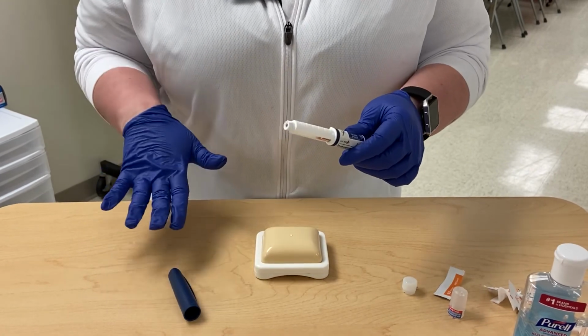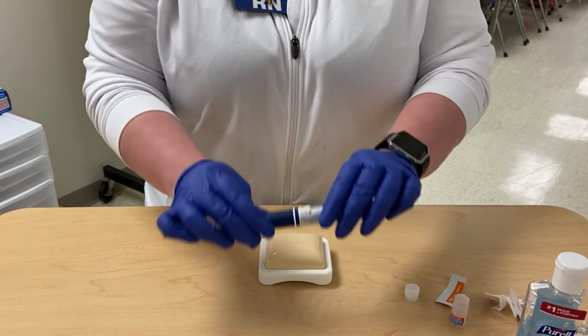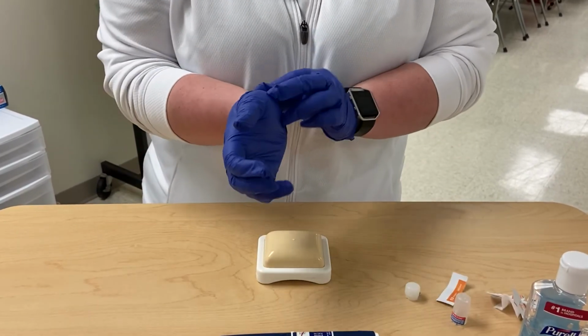Once the needle is discarded, place the cap back on the pen and replace the insulin back in the medication drawer and perform proper hand hygiene.